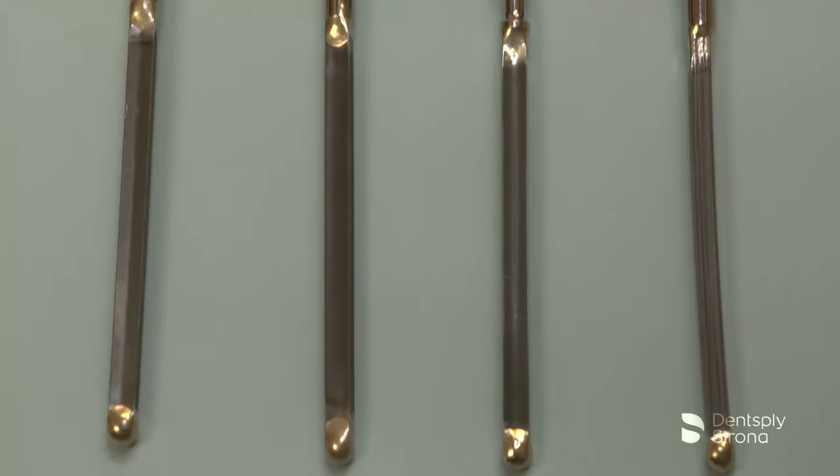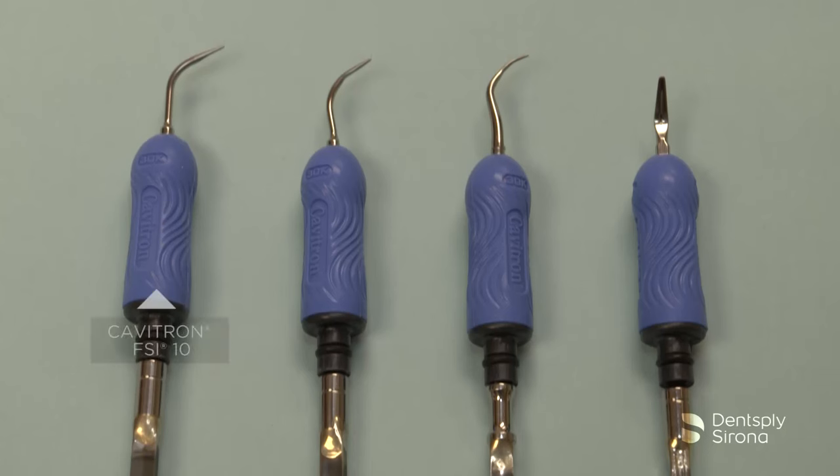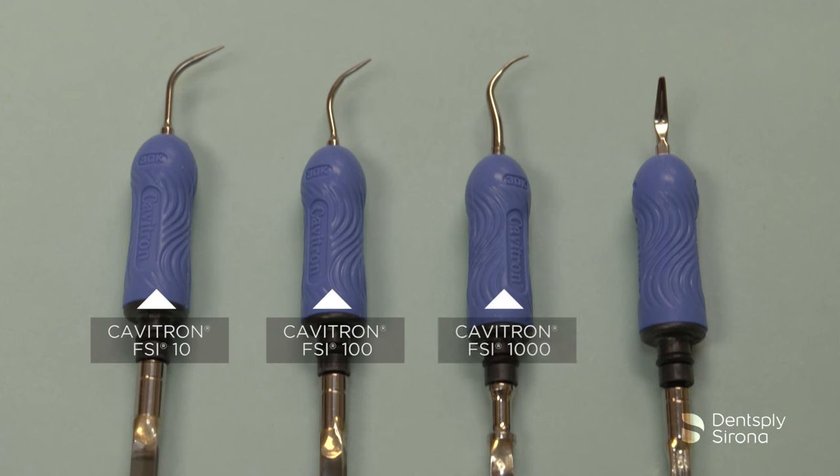There are four standard inserts commonly used during initial gross debridement procedures: the Cavitron FSI-10, the Cavitron FSI-100, the Cavitron FSI-1000, and the Cavitron FSI-3 beaver tail. The standard diameter inserts are specifically designed for efficiently removing moderate to heavy deposits.